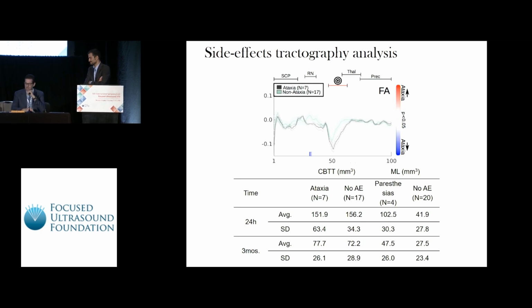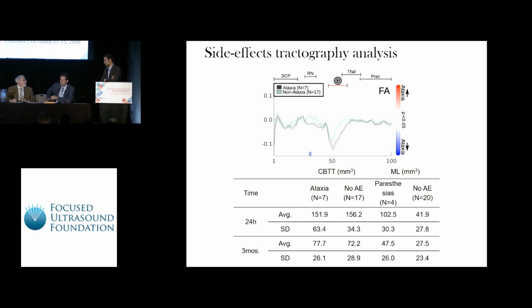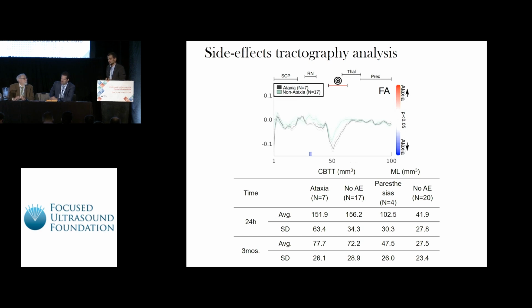Now, does your imaging include corticobulbar? And the question is, is there any correlation with dysarthria, which does occur in some of those patients? No. As far as I remember, we didn't have dysarthria. We had one patient who had a decreased verbal fluency or fluency of speech, and you cannot correlate to that. Maybe we could find it if we had more patients with dysarthria. Probably, in fact, but we don't have enough patients developing dysarthria.